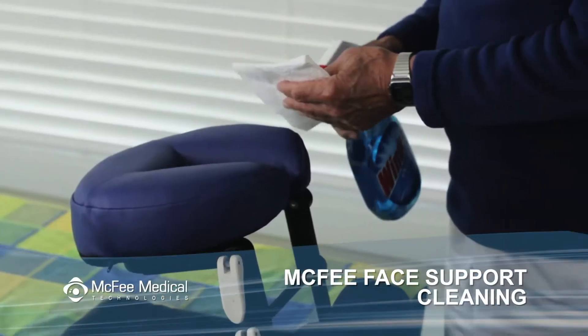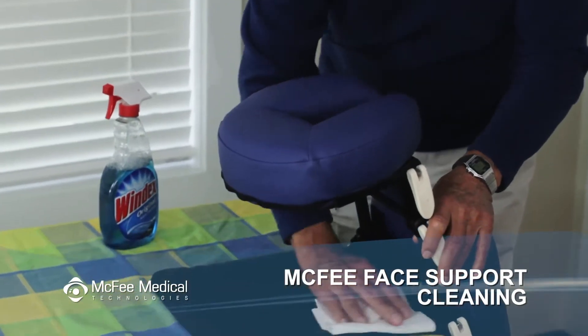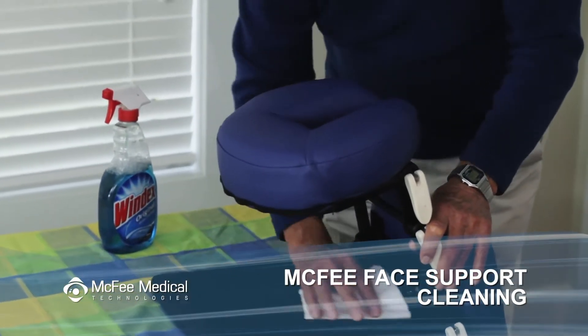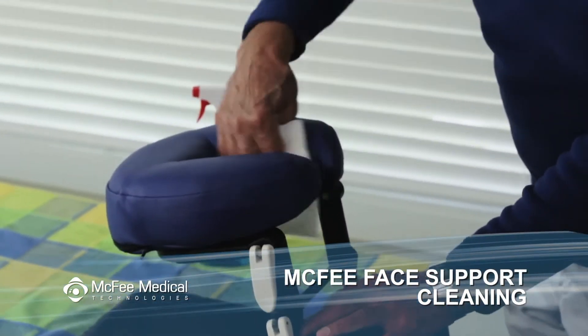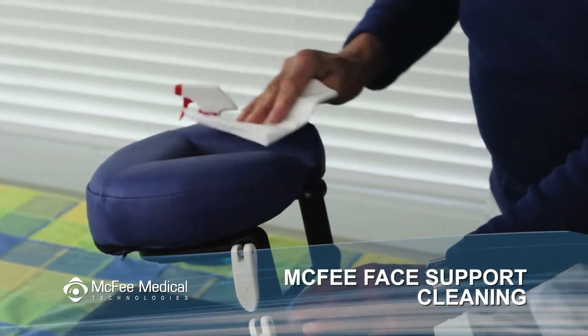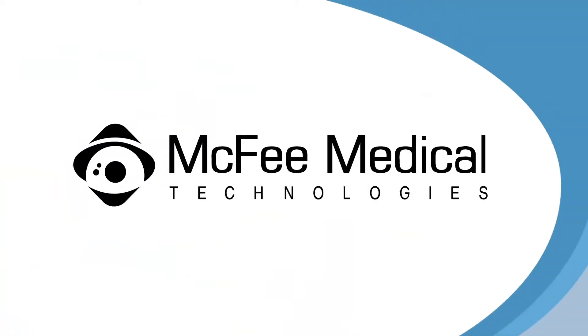The McPhee tabletop face support can be easily cleaned. Simply wipe down with a damp cloth. If needed, you can use a mild soap with water to wipe down your equipment. If desired, the flannel covers can also be washed in the washing machine and dried in the dryer for repeated use.